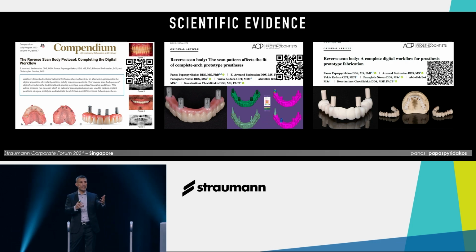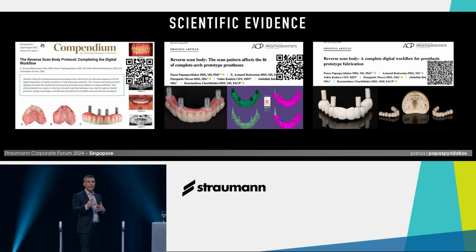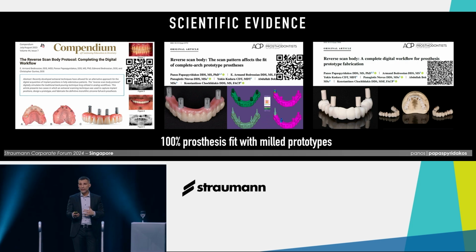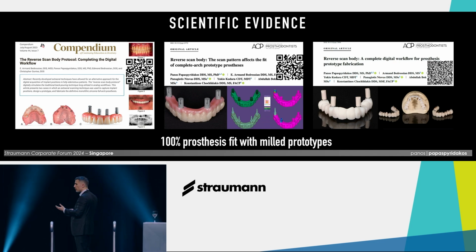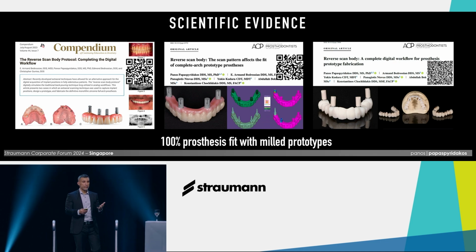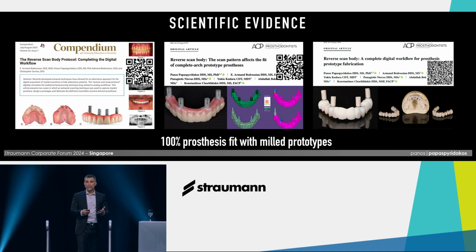Not that the 3D printing does not work, but it does not lead to 100% accuracy of it, as in our studies. So if you implement this new protocol and you use milling technology, you will get 100% fit of your prototype.